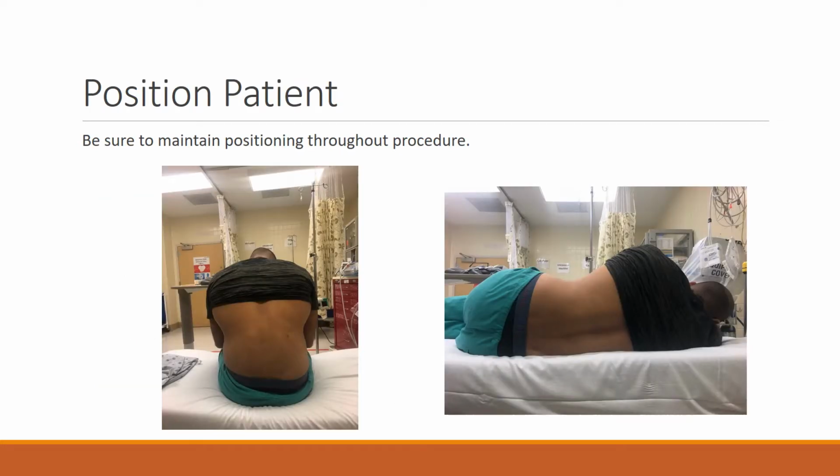So begin with the positioning of the patient. The important thing is once you've positioned the patient, make sure that they don't move, because if they move, then the marks that you've made are no longer going to work.